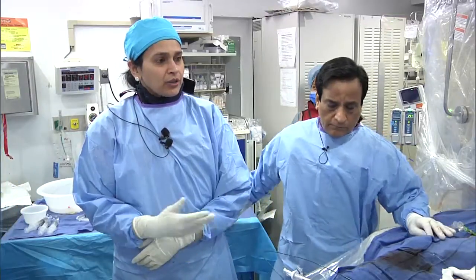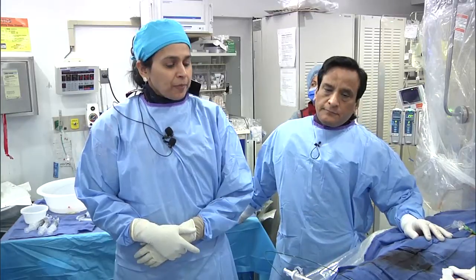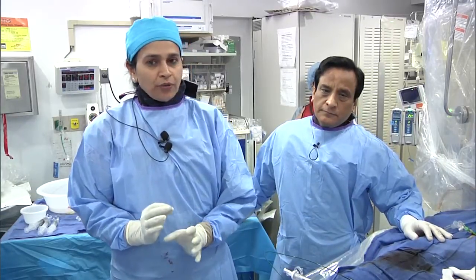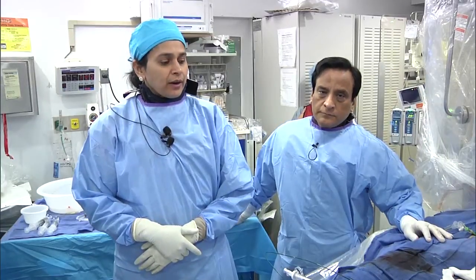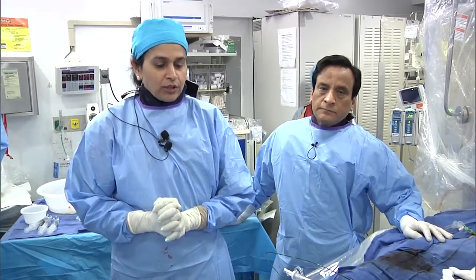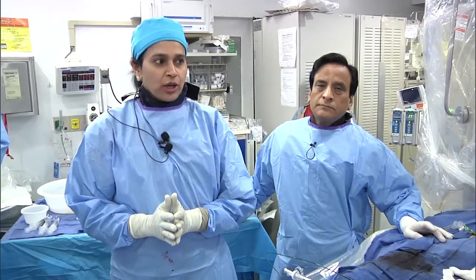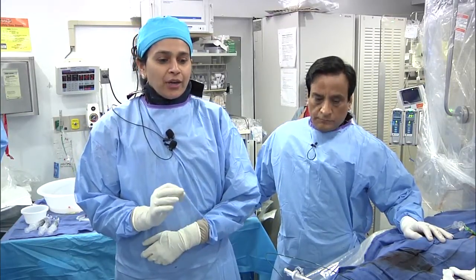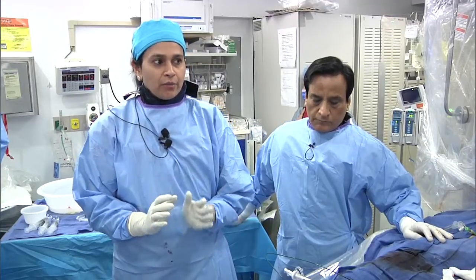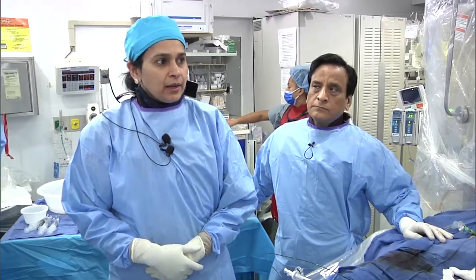1 or 2 minutes where you escalate your wire. With a regular workhorse wire, go to the CTO area and just try with the soft wire gently. The soft wire is whatever, either the Fielder, and there is always this concept of using Fielder XT if there is a microchannel. Again, the microchannel concept is for the chronic microchannels. Even with the Fielder XT, it may go to some extent. Later on, you may need a little stiffer wire. That's the time, if you think you need, you progress to the Pilot family.